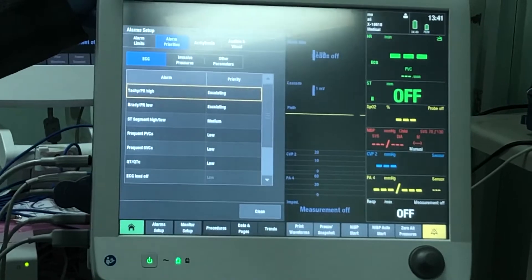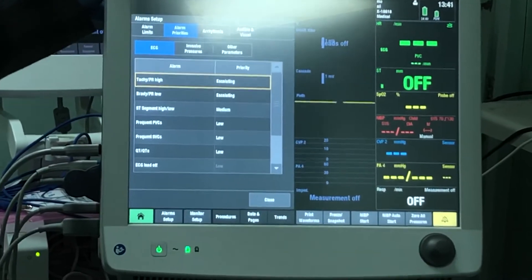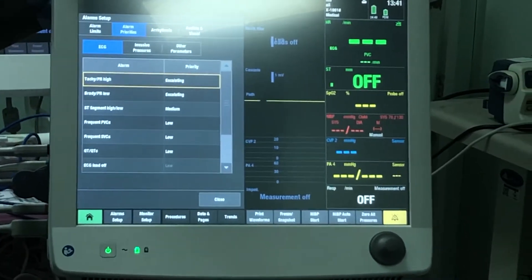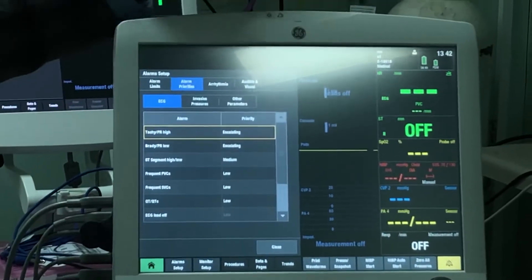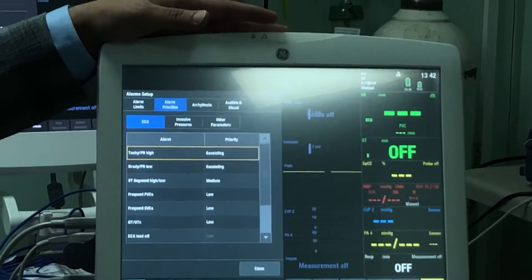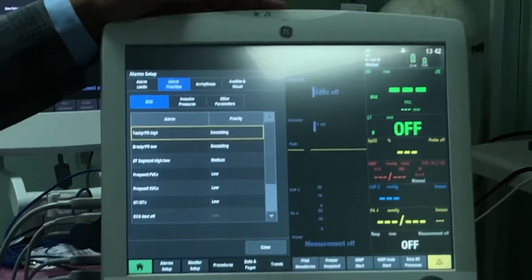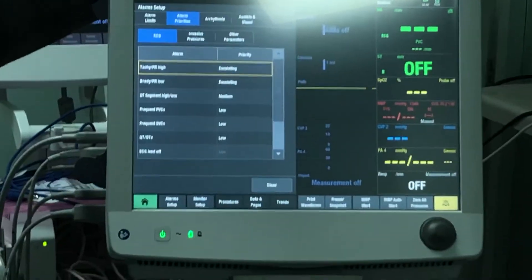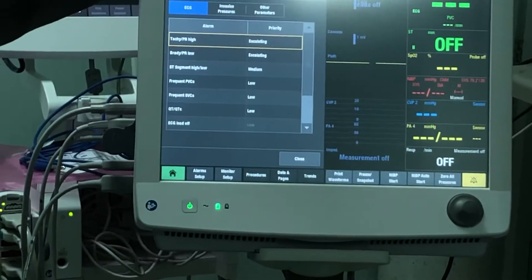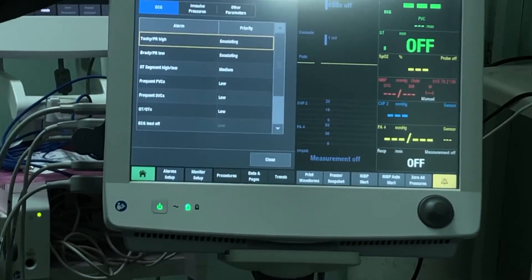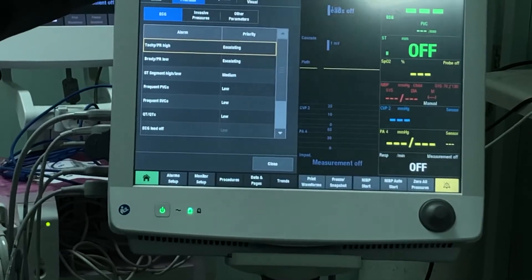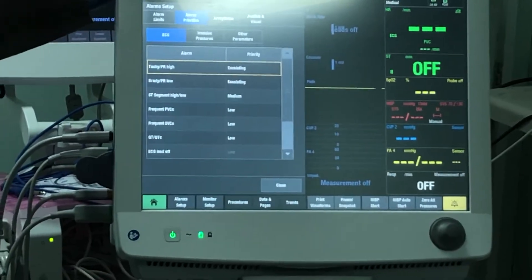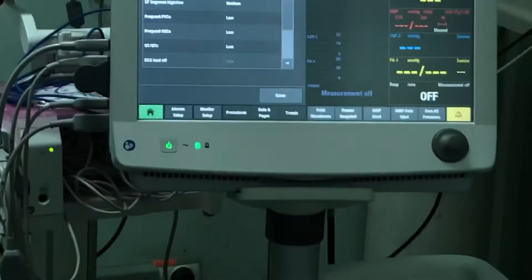The alarm priorities are designed to differentiate between alarms, because not all alarms are the same. We have low, medium, high, and escalating. Low priority is indicated by the color blue, medium is yellow, and high is red. It's important to understand the difference between low and medium alarms versus high alarms.